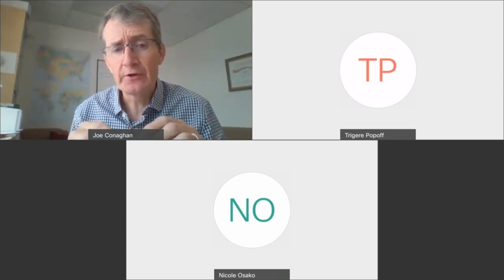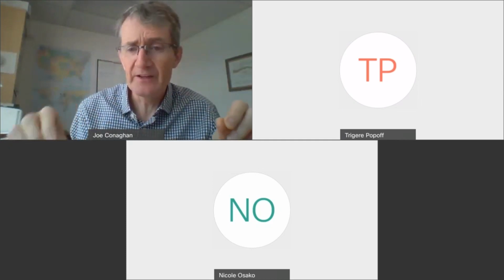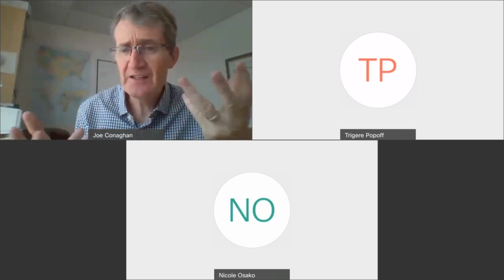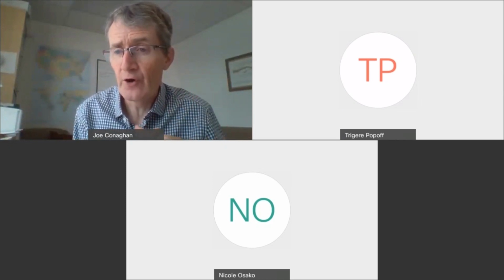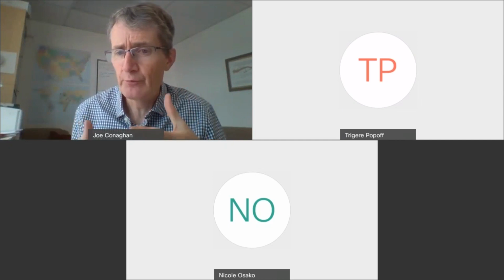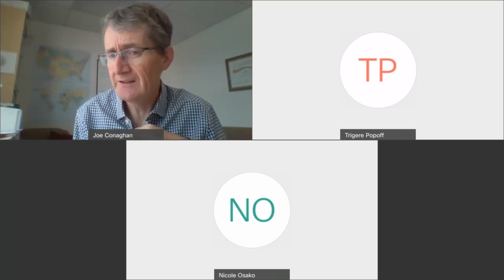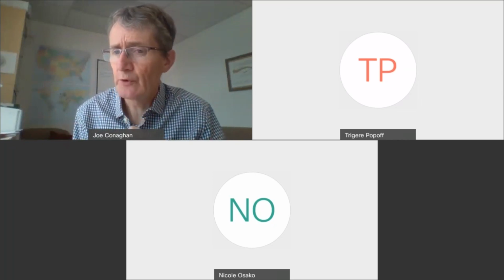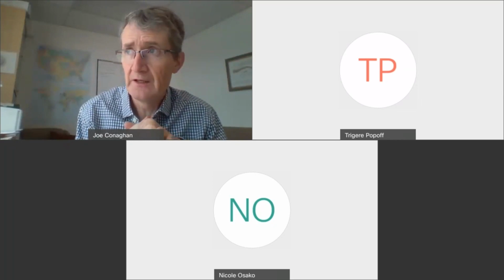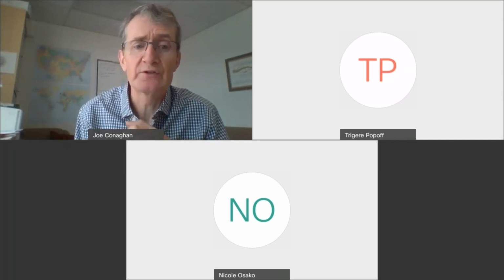I like taking the cryolock out of the liquid nitrogen and then briefly pausing to take the cap off and then going into the thaw solution. That sort of 1 second interval that it takes me to take the cap off allows any liquid nitrogen that's on the device to evaporate before I go into the thaw solution. If you get liquid nitrogen into the thaw solution, it's going to bubble, it's going to produce gas, it's going to obscure your view, and it's just going to make things a little more difficult for you than they need to be. So I like the concept where you take it out of the liquid nitrogen, quickly pull the cap off and go in, because that allows that liquid nitrogen to evaporate before you get the device into your thaw solution. But there are more ways than one to do this, so whatever works for you.